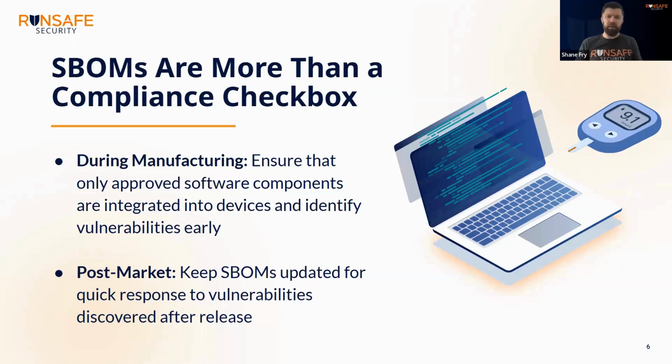Anybody can generate an SBOM, but if you don't care if it's accurate, if you don't care if it's complete, if you're not acting on that SBOM, using that to identify the vulnerabilities that are present there, then you don't know when you go to ship software that you've shipped something that's got a bunch of vulnerabilities in it as a device manufacturer. And on the asset owner side, the provider side, you don't know if you're receiving software that has a bunch of vulnerabilities in it, right?